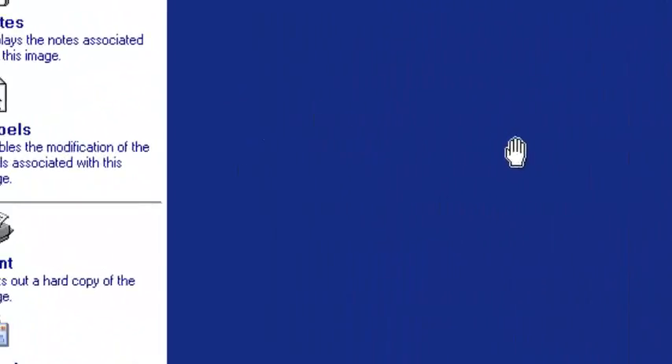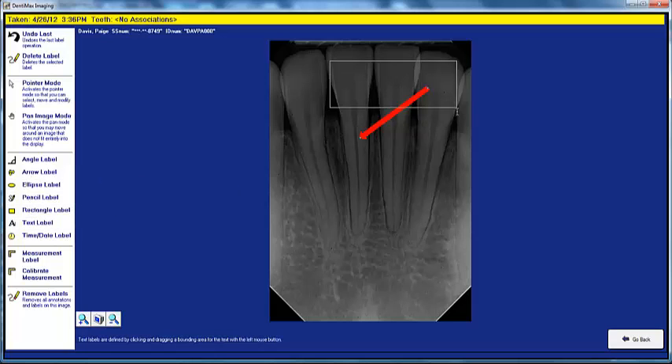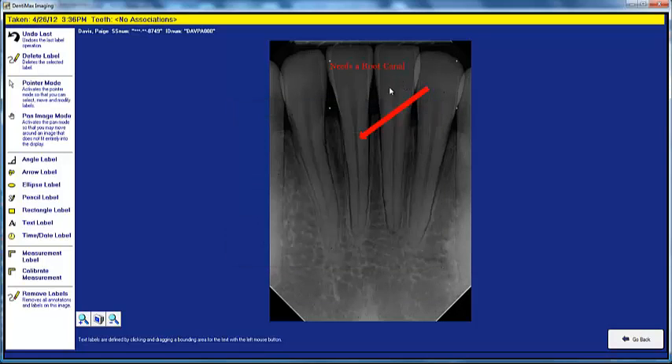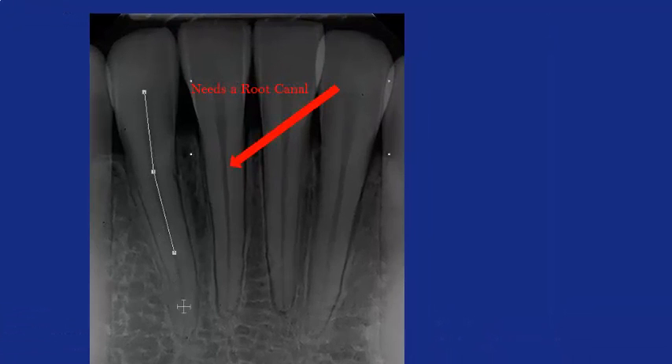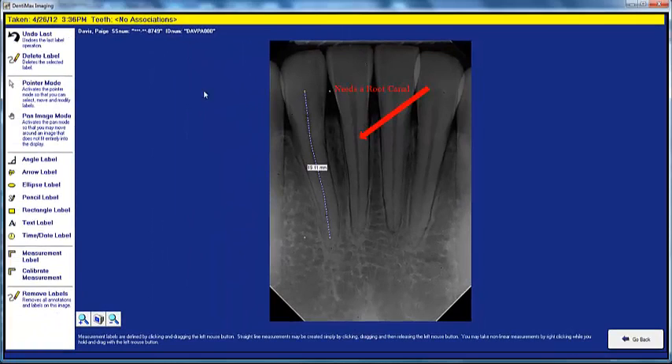Digital imaging is also a great way to educate your patients. Click on the Label button on the left-hand side. You can draw arrows on your image to point something out, and put a text label next to it — for example, 'it needs a root canal.' You can also measure the length of a root using the Measurement Label button, clicking along the root canal to show the curves. In this case, we have a 19.11 millimeter root canal. After patient education, click the Undo button to declutter the screen and remove the items you placed.